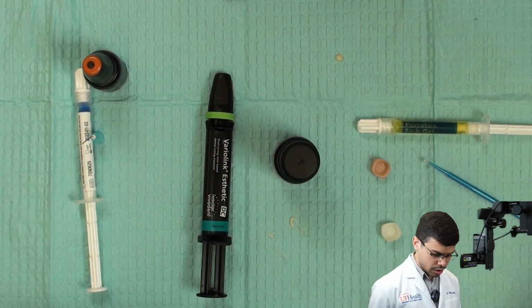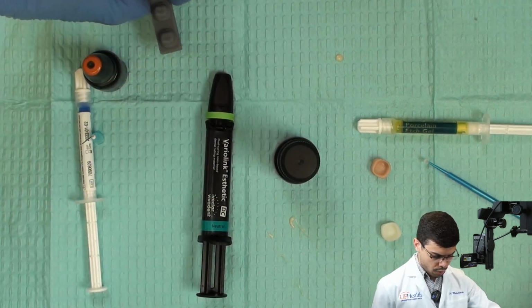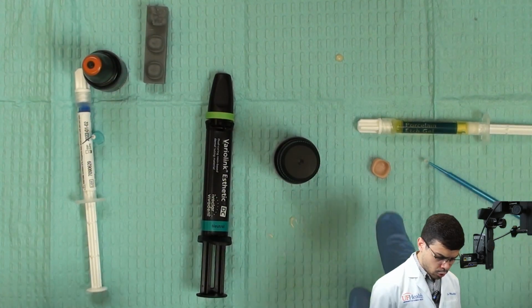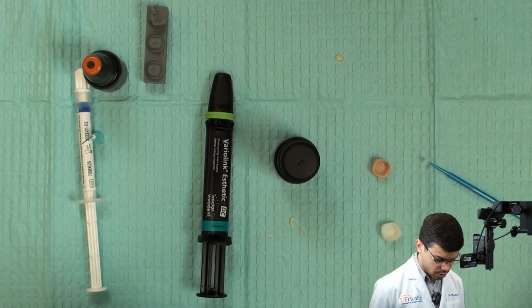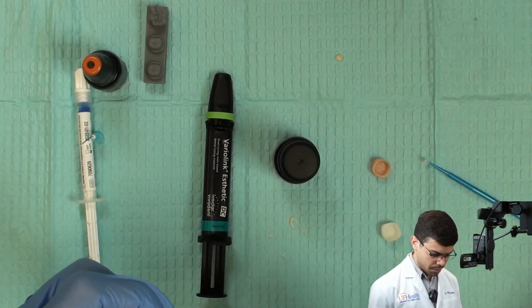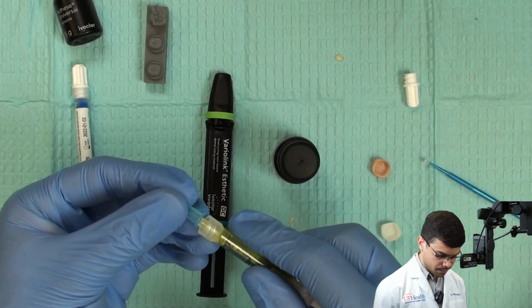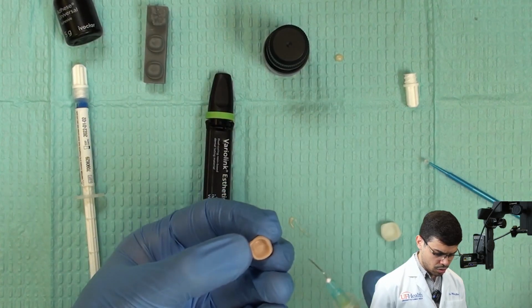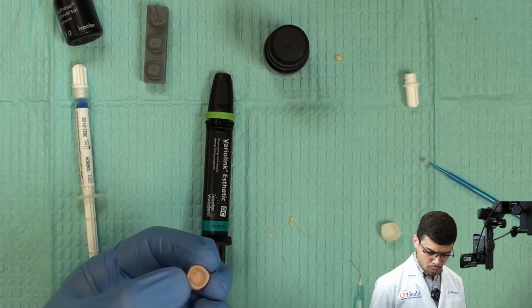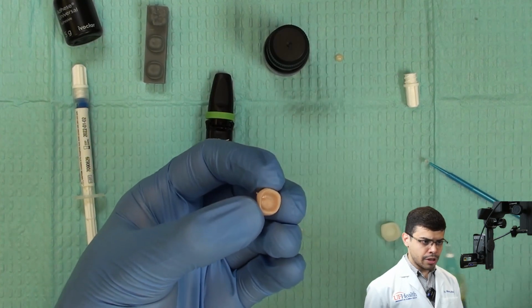So how do I start? You never start on the tooth because you're gonna need more time for it. So first you start with the ceramic. Let's start with the glass ceramic here first. With the glass ceramic, first of all, I'm going to get the etching here, and then I'm gonna apply the etching on the ceramic. What's important to know is that the etching time for each ceramic is different.